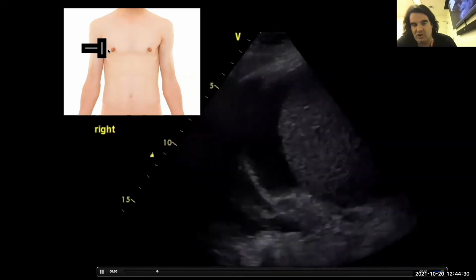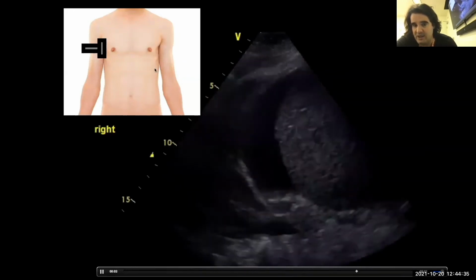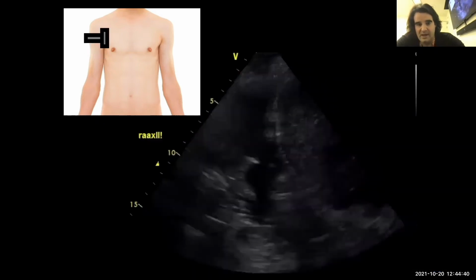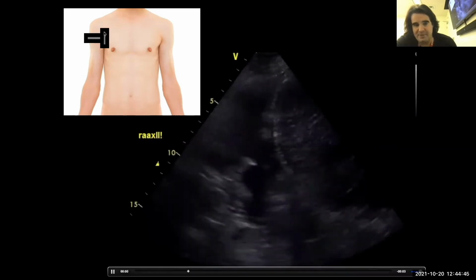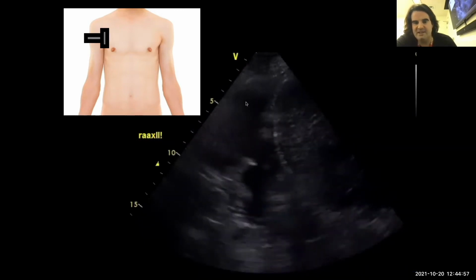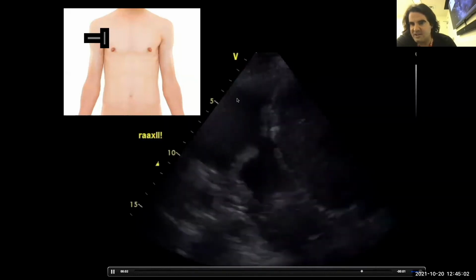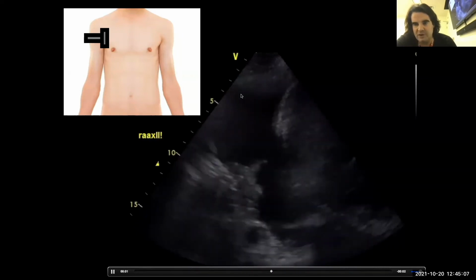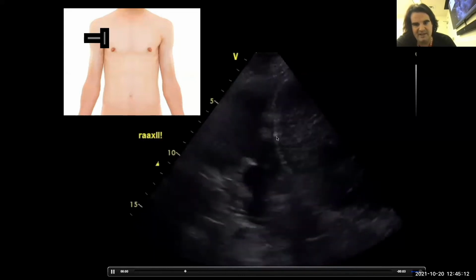But as you pointed out, Charles, it's pretty high in the chest. This is actually where the chest tube would be inserted. The chest tube would be inserted squarely into the diaphragm. Looking up a little more, this was around the third intercostal space, but quite lateral. The diaphragm is still visible. And yes, there is a pleural effusion here and some consolidation, but this is actually a very small space. And so the question becomes, you could drain this, but will this fix the problem, if this is the issue?